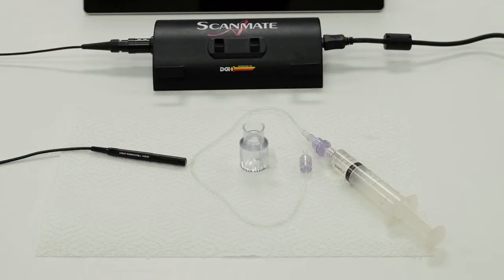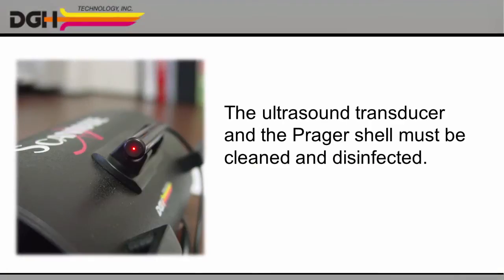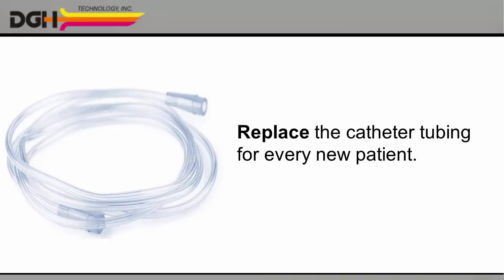First, prepare your equipment. You'll need the DGH6000 transducer, a saline reservoir like a syringe or a squeeze bottle, plastic catheter tubing, and a Prager shell designed to work with the DGH6000 probe. Both the ultrasound transducer and the Prager shell must be cleaned and disinfected before each biometry procedure. Please see the user manual for complete instructions. In addition, the sterile catheter tubing must be replaced for each new patient to prevent cross-contamination.